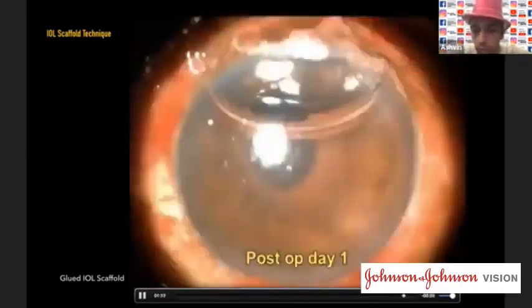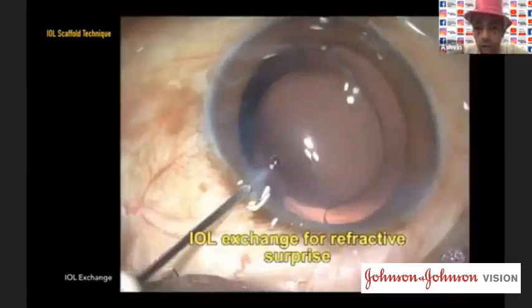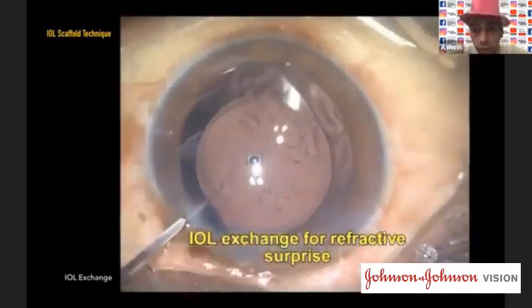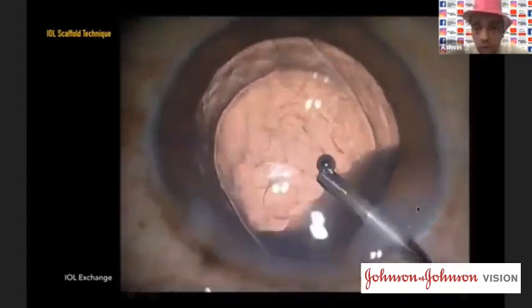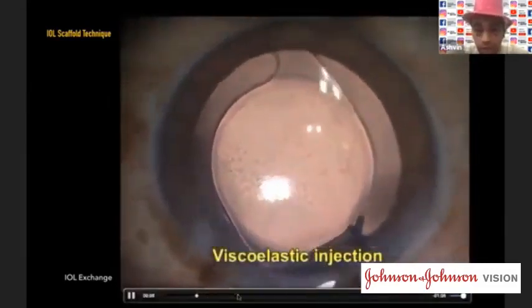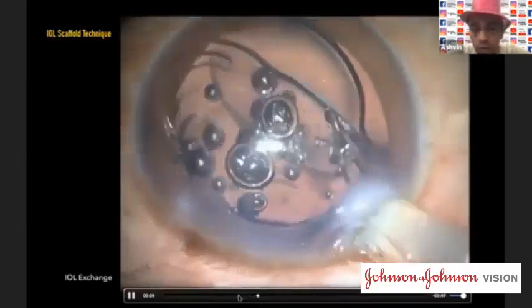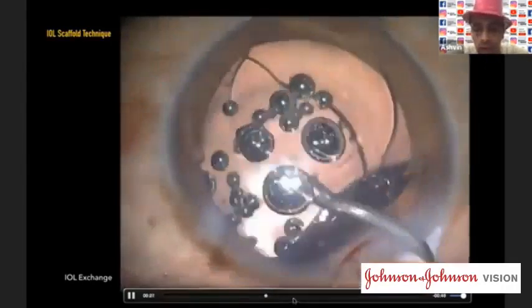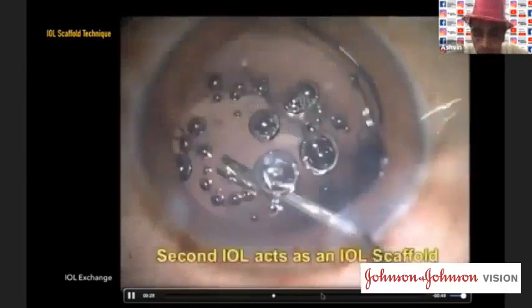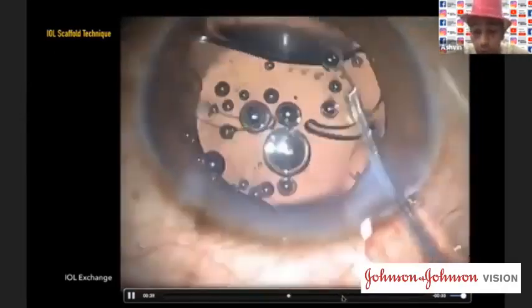I think that's more important, day one. This trick can also be used for IOL exchanges, because there's a fear that when you're trying to cut that intraocular lens, you can always cut the bag as well, or poke the bag. Placing an intraocular lens behind the IOL before you cut can always prevent you from a posterior capsular rupture that is imminent and very, very possible if you don't do this. So it's helped me in a lot of situations.